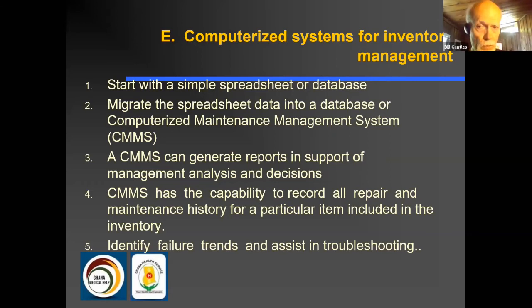So we're going to be transitioning all of the information that we've received on Excel spreadsheets into this new database. The importation of data from Excel spreadsheets to database programs is fairly straightforward, and I'll show some examples of that in a few minutes. As I mentioned, it's fairly easy to migrate the spreadsheet data into a database. We're going to be using a Microsoft Access database.